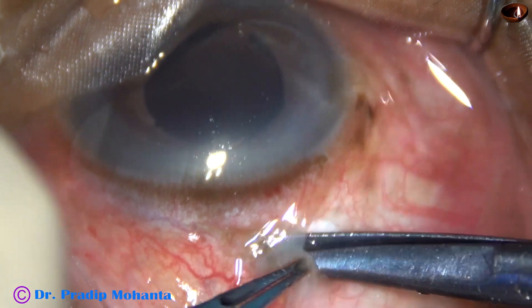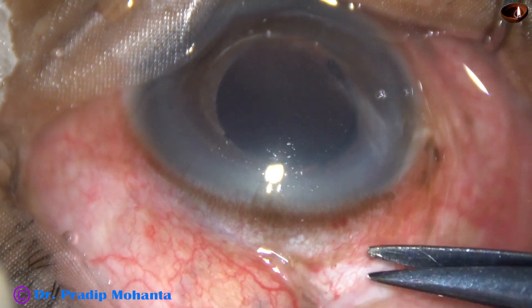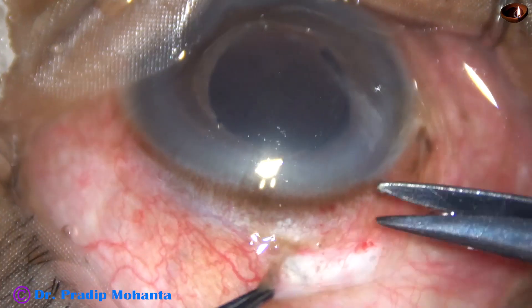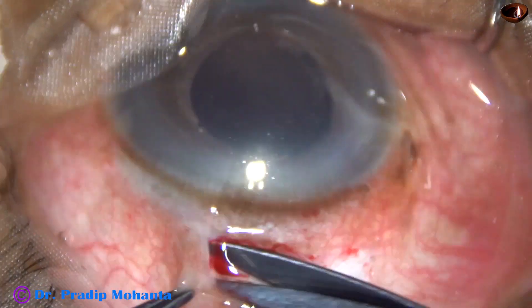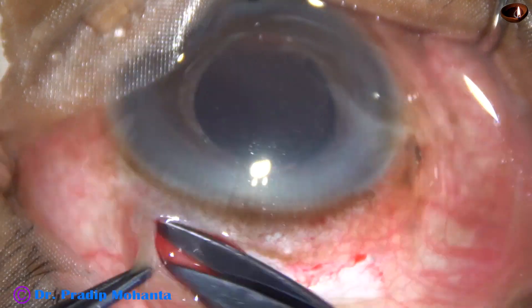With medications, it has come down to 26 mm of mercury and I have taken the case for surgery. My plan is to remove this anterior chamber intraocular lens, do anterior vitrectomy, and implant an iris claw lens.